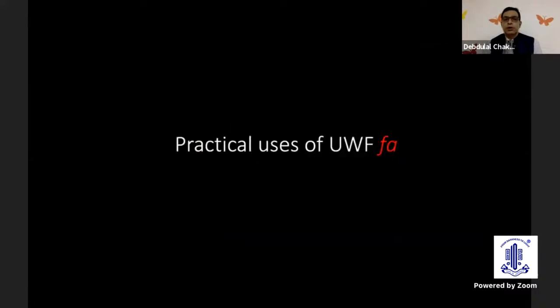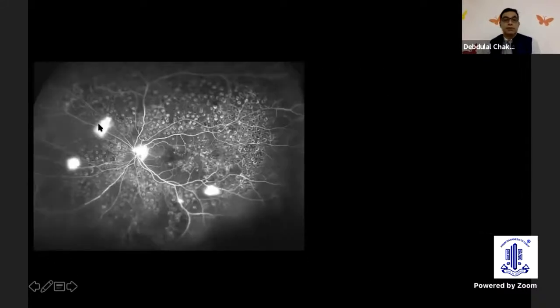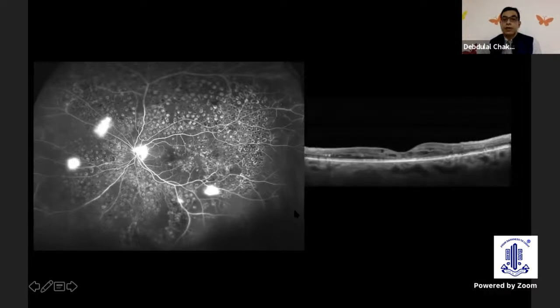Now, showing you just a couple of practical uses of the ultra-widefield FA. So this is a 55-year-old lady with recalcitrant diabetic macular edema after umpteen number of injections. When she presented to me, I thought that there could be some peripheral ischemia. So we did this Optos imaging, and we could find plenty of areas of peripheral ischemia, which had not been well covered with the laser. So we did laser, and in 2 months' time, she did better without any more injections. So this is an important area which we have to look into.